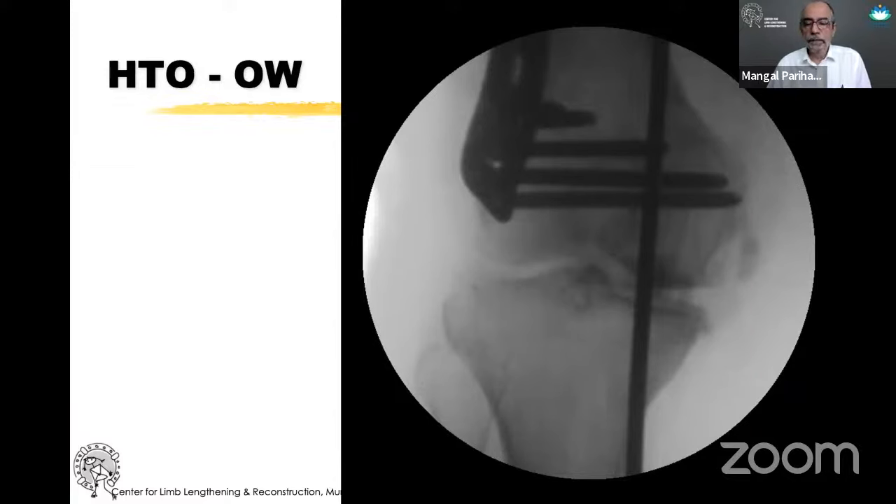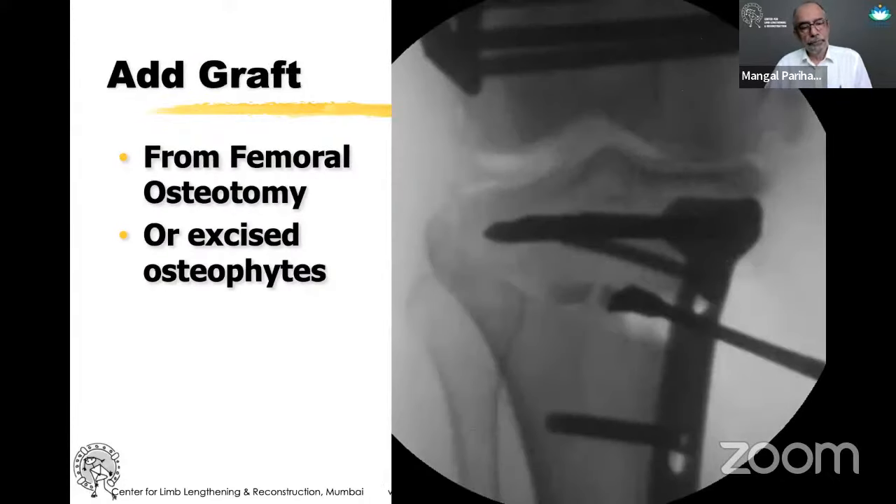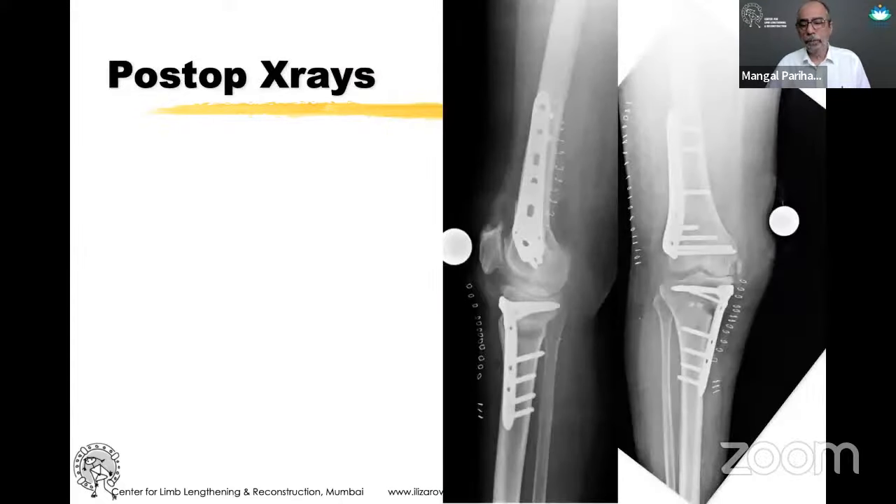You can see the alignment rod is still medial, and therefore that's the amount of correction needed in the HTO. We do a regular Tomofix in this case, where intraoperatively the alignment rod is around the base of the lateral tibial spine so that we are unloading the medial side enough. Since we've done a femoral osteotomy, I use that opportunity to add the wedge removed from the femur into the tibial opening. Sometimes osteophytes excised during knee debridement can also be added to this region. That's her post-op x-ray with femur and tibia both osteotomized.